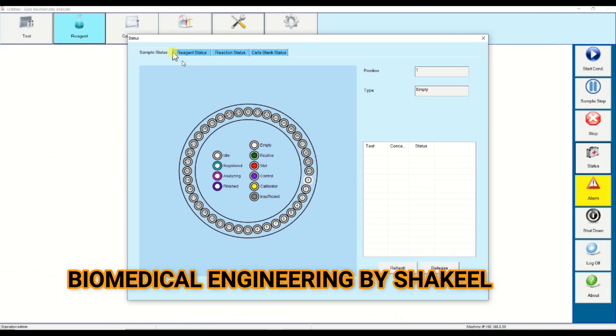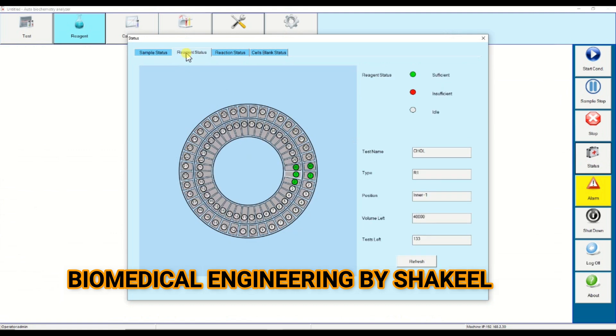If you want to see the status of the reagent, click on reagent, then reagent status. Here it will show you all the assigned positions.